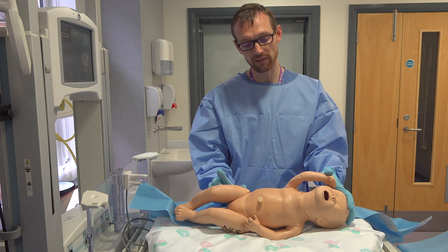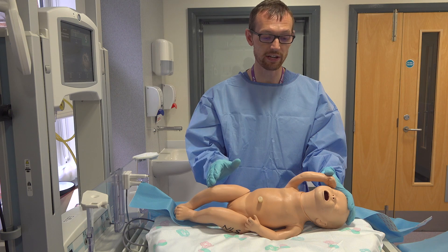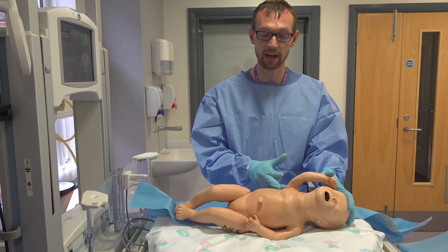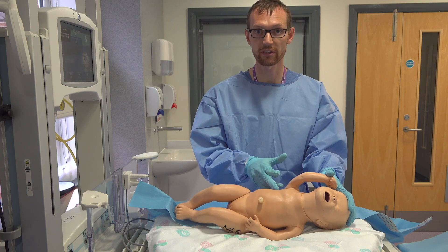Remember pain relief — at the senior's discretion, whether you give fentanyl or ketamine. And we always will inject some local anaesthetic lignocaine into the insertion site.